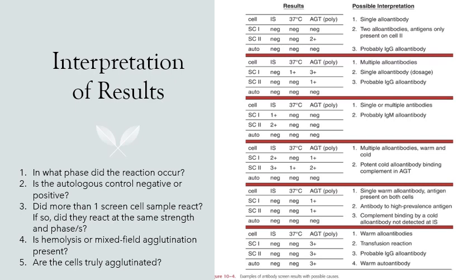Now, let us try to interpret figure 10.4. Here, the first one has a negative reaction in all phases. Next has a 2+ reaction in the AHG phase, and the autocontrol has no reaction.